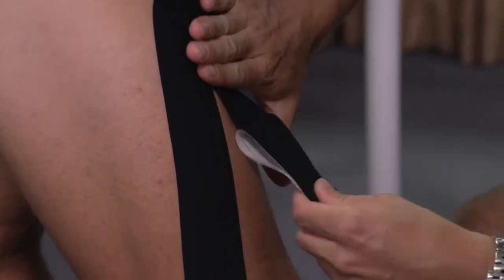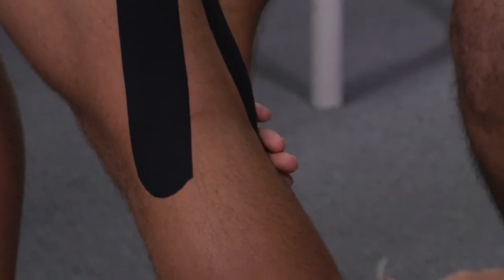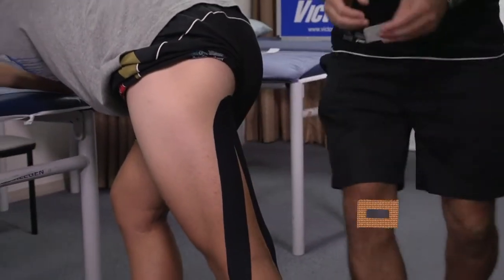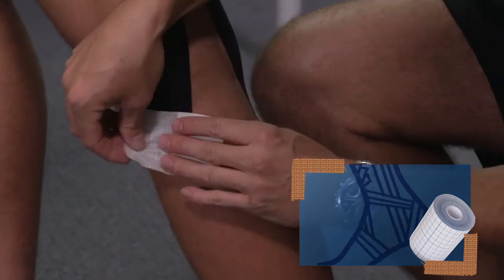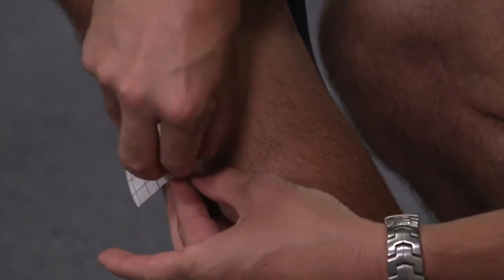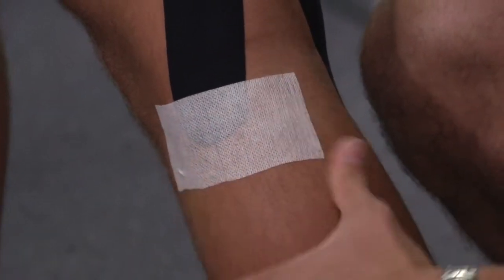Again, the origin, this time semimembranosus, semitendinosus. We can then lock them off.